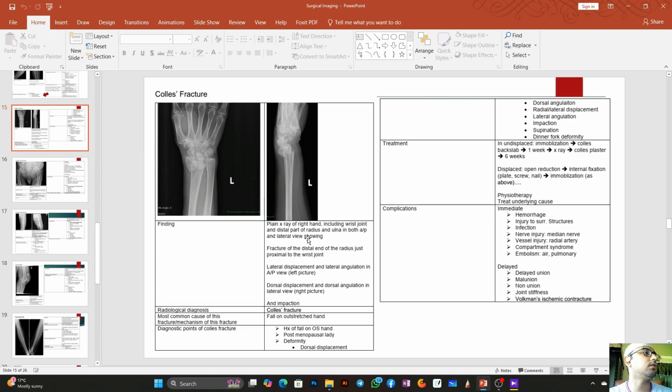I think you have to see a lot of X-rays, a lot of MRCP and CT and MRI to gain some knowledge, so that it will be smooth to diagnose different hepatobiliary diseases, and also intra-abdominal malignancies, primary lesions, secondary lesions, dilatations. So in many things you will diagnose after seeing a lot of X-ray and MRI films.